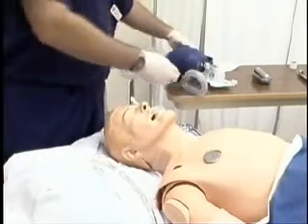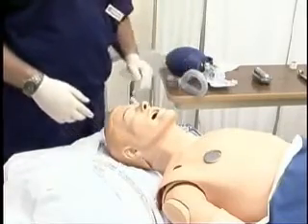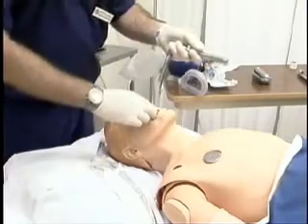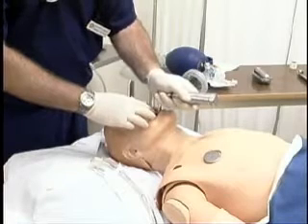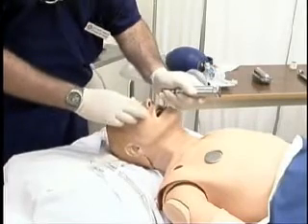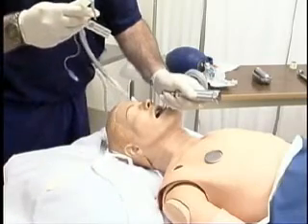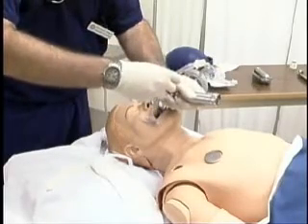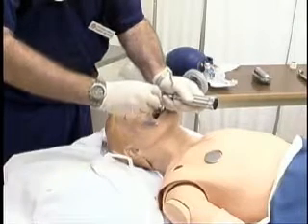We're going to take out the oral airway. Our tube's already prepared — we have the stylet in place and we've already checked the balloon to make sure that it will inflate. We've got the working laryngoscope blade. We have a Miller blade, so we're going to go on the right side of the mouth and go in down the base of the tongue. With the Miller blade, we're going to go underneath the epiglottis and lift the entire epiglottis up in a straight upward motion, not rocking on the teeth. I'm going to place the endotracheal tube down the right side, visualize the vocal cords, and pass the tube directly just past the vocal cords and into the airway.